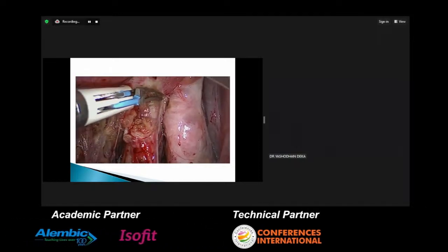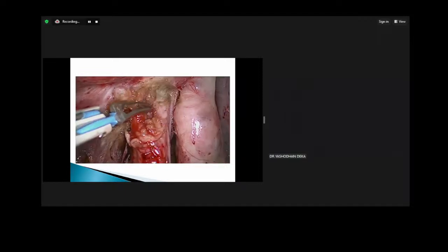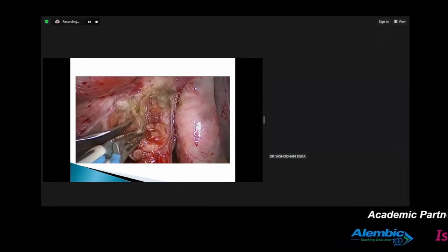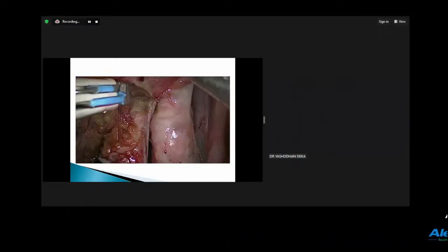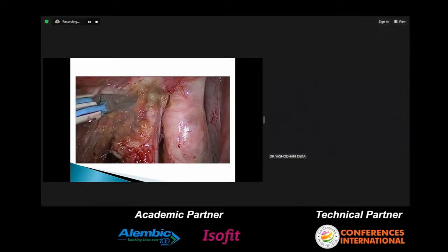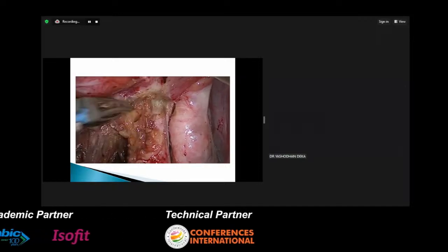And when you cut with the scissors, you can actually feel it. You can navigate yourself through the tissues, because after doing a lot of endometriosis cases, you will realize that even if your imaging was not up to the mark, you can just follow the tissues and identify it. And if you have an excellent imaging system, literally you just follow the fat, because the involved fat looks different from a normal fat.